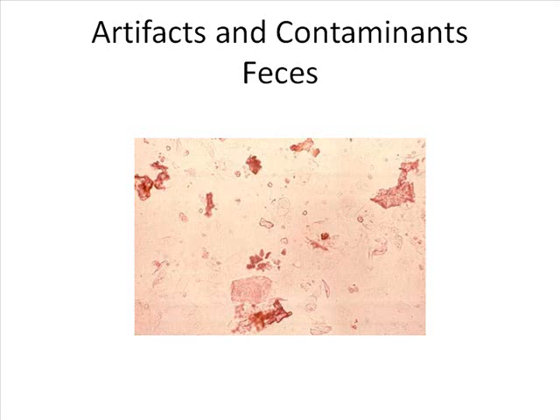It is okay to report appears to be contaminated with feces. You guys know what feces looks like because you've looked at it doing O&P exams and even gram stains. It is filled with a lot of food material, all right? And you should reject this type of specimen or note that it appears to be contaminated with feces, request new specimen.